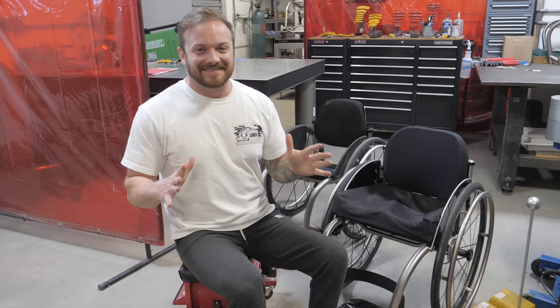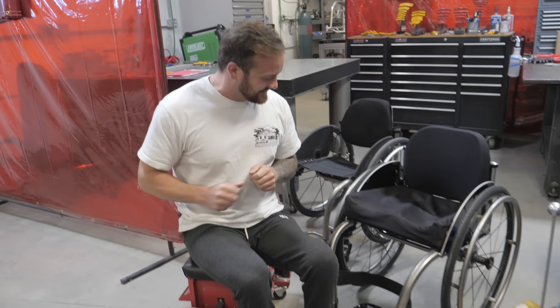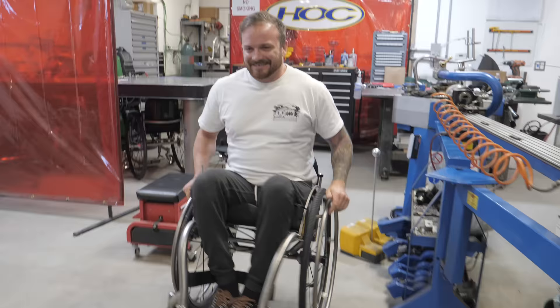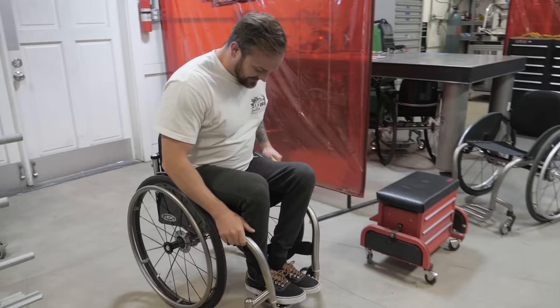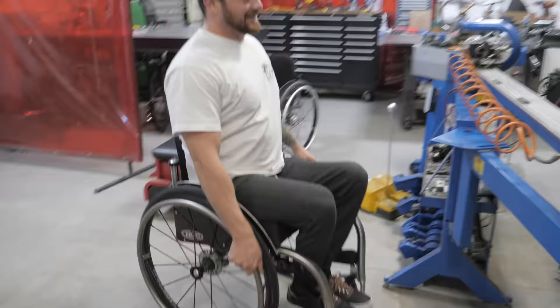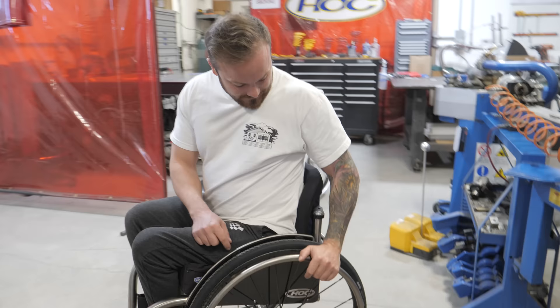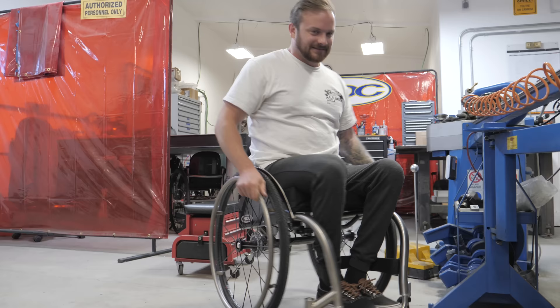This will be the first time transferring into my brand new Hands-On Concepts chair. It fits like a glove, man! That feels real nice. The center of gravity feels good, the width feels good. I'm really excited about these clothing guards — I don't know why I'm so excited about them, because I've never had ones that are welded in. This new back strap feels good.